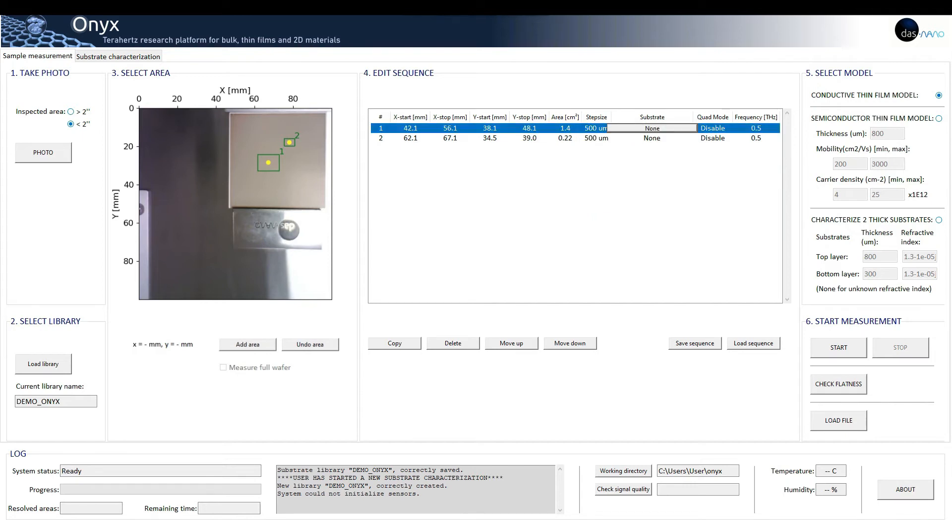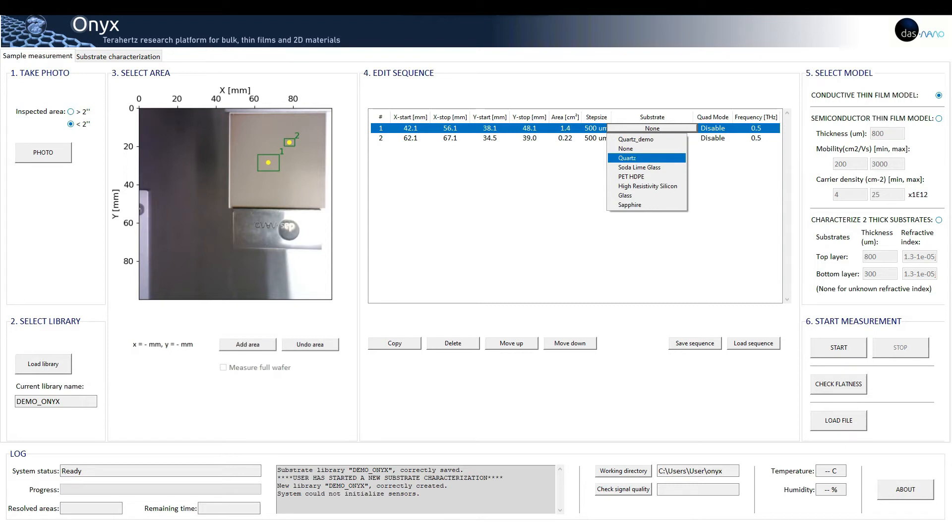The substrate used, as you can see, the pre-characterized substrate called Quartz Demo, appears together with other frequently used substrates provided with the instrument.